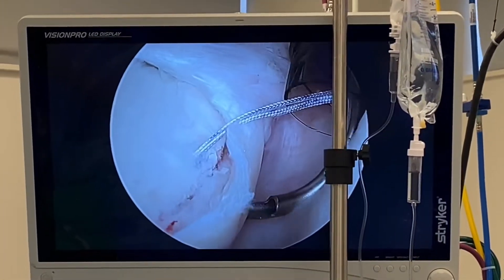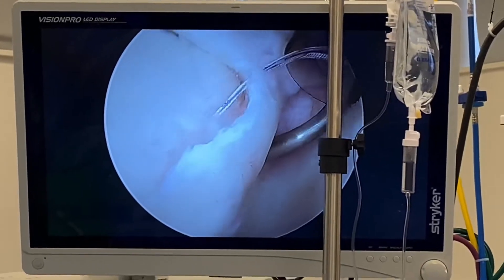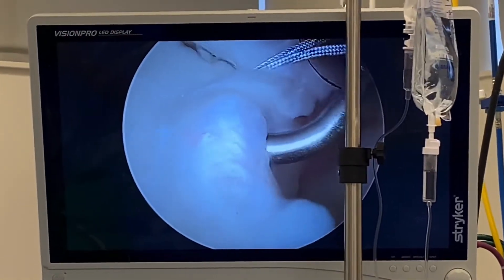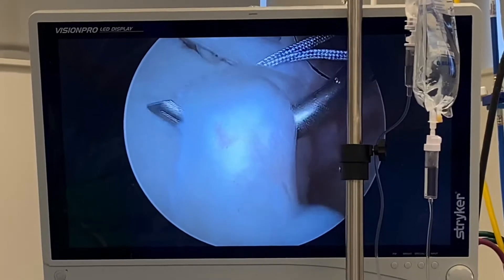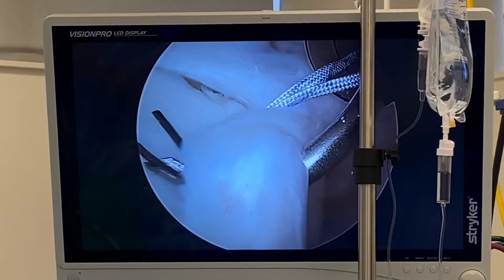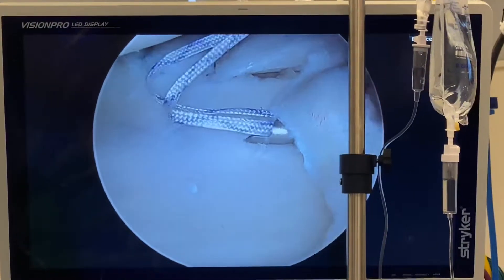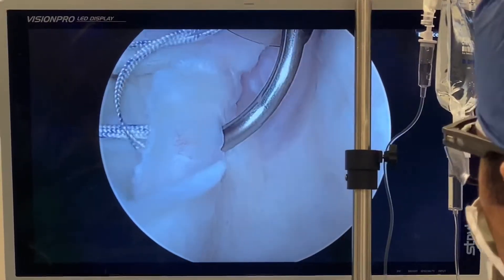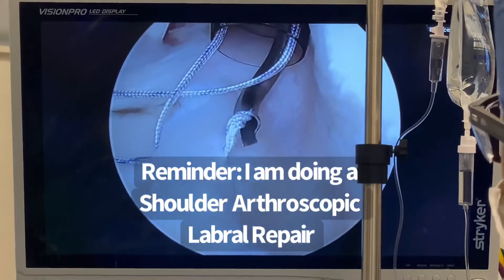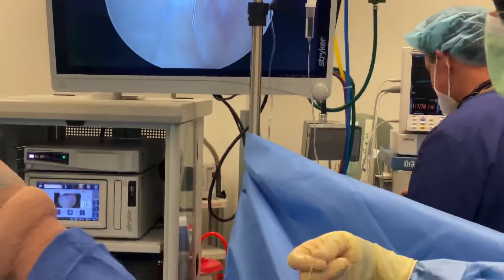Then I use a specialized passer to pull the sutures through the desired repair tissue, pull it up here, penetrate the labrum, and go through it. Then I use this capture device — it's a slingshot design — to grab the suture.